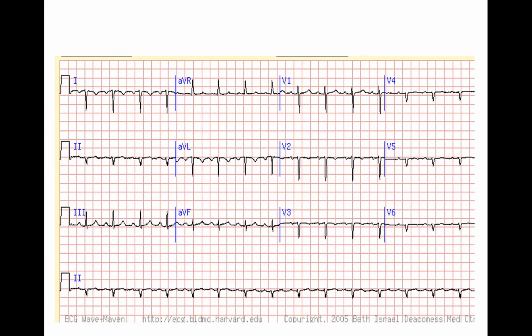And just to remind you, guys, with this ECG, you should always go systematic. That is better because anchoring and premature closure biases are common. Sometimes you snatch the biggest abnormality, but you miss the rest because you prematurely close the ECG and anchor on that.